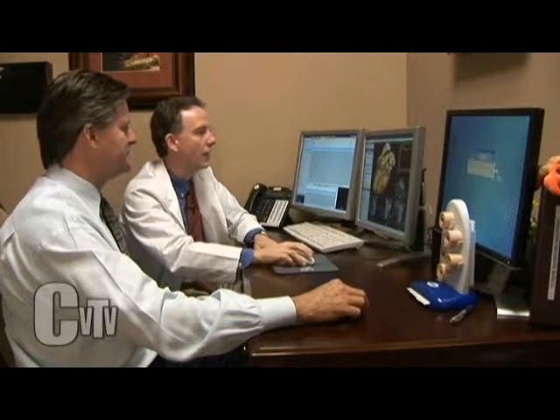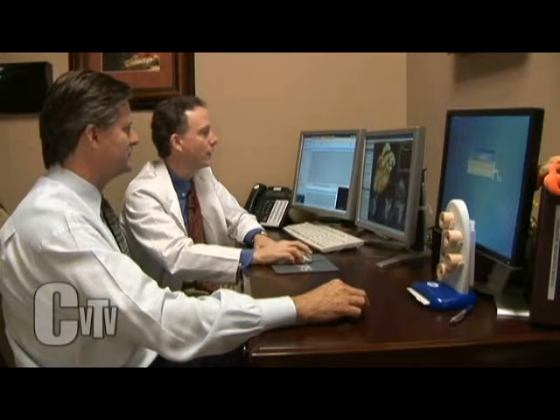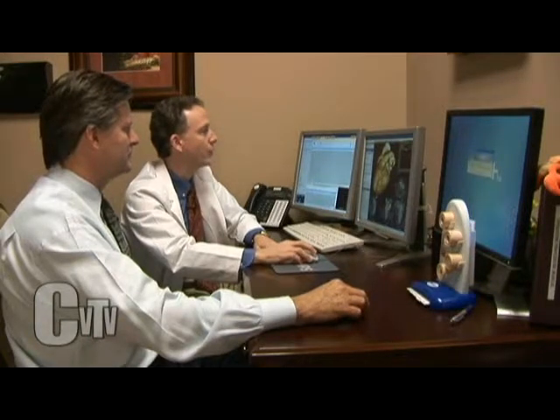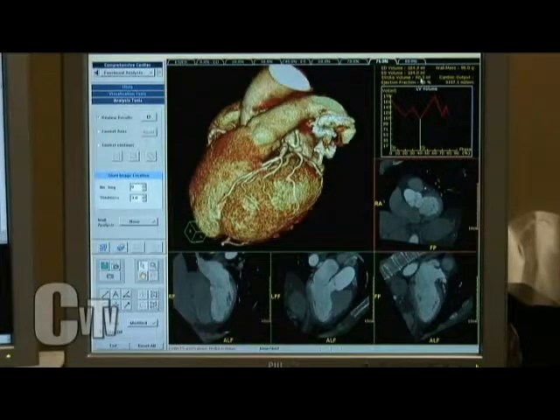Absolutely amazing. We also can calculate all the sizes and dimensions of the heart. We can calculate how much blood the heart pumps per beat and per minute, how much the heart weighs, the efficiency of the heart, and the volume of the heart. We do all that in 10 seconds. So if someone had heart failure, we'd actually see the heart enlarge, and you can measure that. In people who've had it, we can also measure it improving. We can also see evidence of old heart attacks and scars.